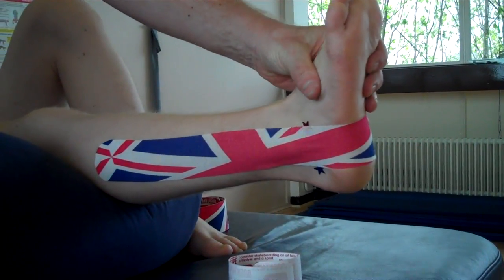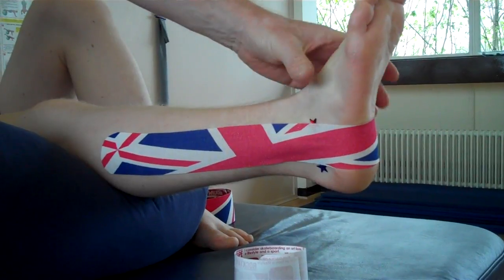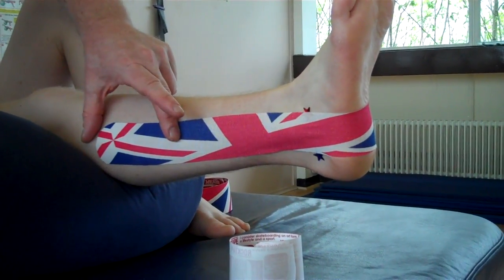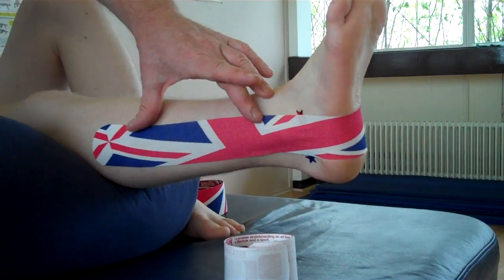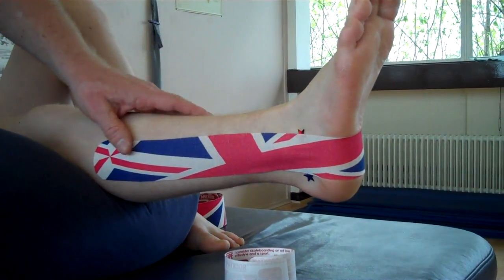That would limit inversion. If you don't want to have it as stable, then we're going to do exactly the same thing again, but we're going to place 75% stretch or even 50% stretch on the tape.